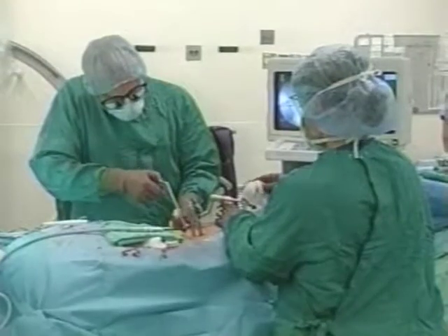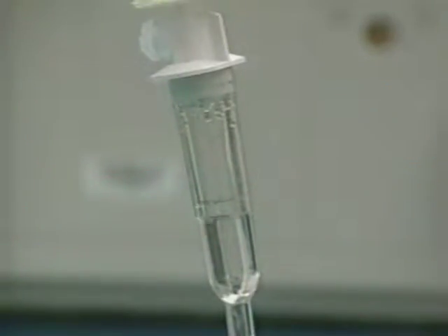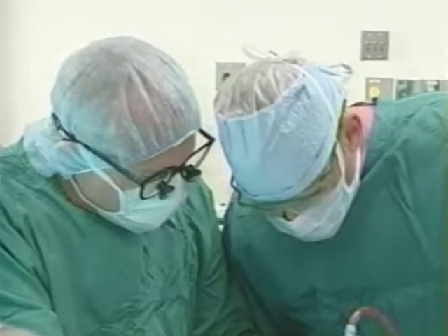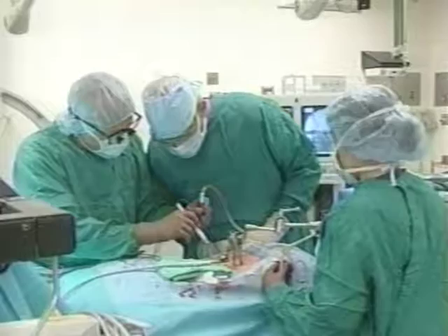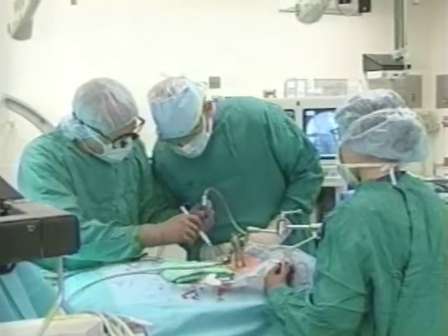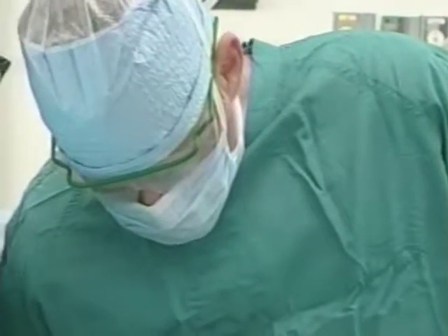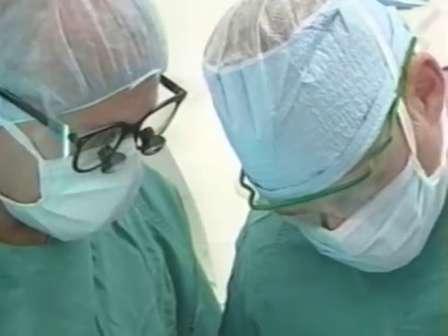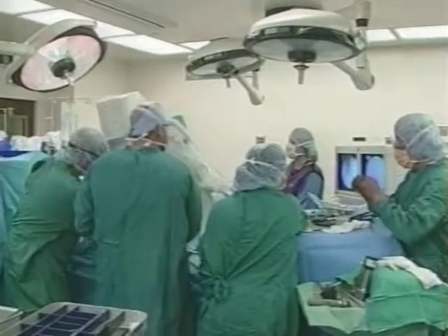From that point, the fusion itself is the same procedure that's been perfected in recent years. But with the new outpatient surgery, recovery is much quicker and much less painful for the patient. Once it's done, you remove the tube, the muscle falls back together. And since you haven't cut any muscles, you've just separated the tissues, there's no pain, scarring, stiffness related to that. Within just about 3 hours, the patient goes home, resumes normal activity within a week, and can return to work in half the time necessary with a traditional surgery.